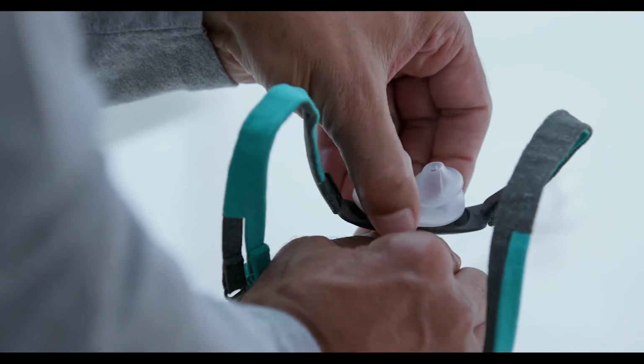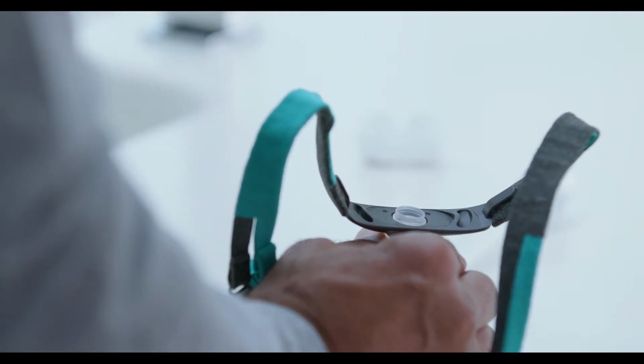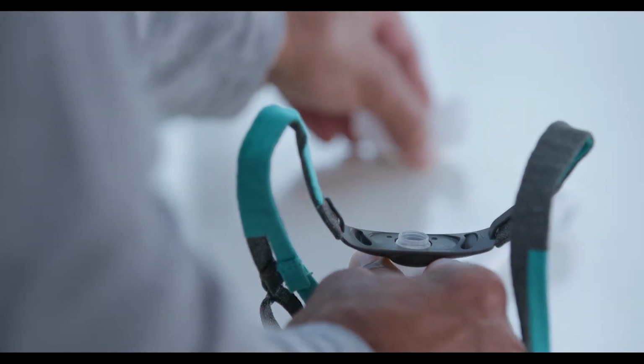Take your mask apart by grasping the back of the cushion and pulling it away from the frame. Whether you're using a silicone pillows or nasal cradle cushion, you will feel a pull when the magnets separate.